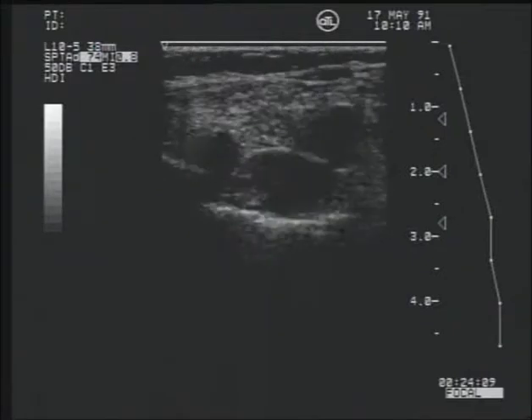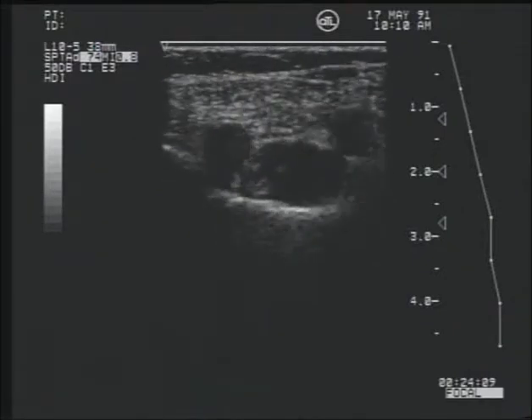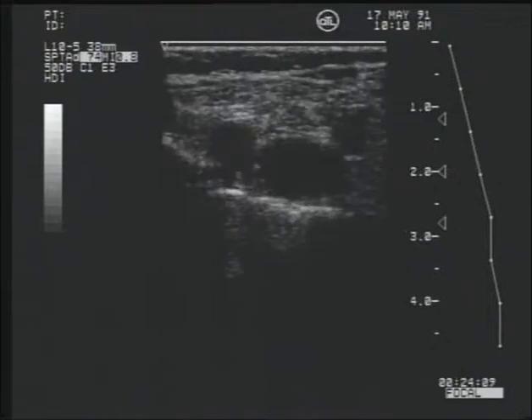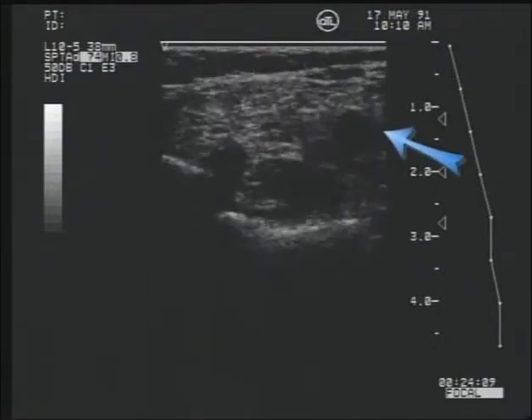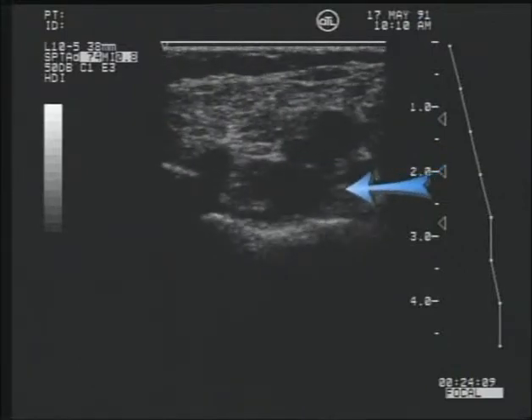Once a suspected cyst is identified, care should be taken to make sure it is not an enlarged vascular structure by identifying the popliteal vessels and noting the separation between the vessels and the cyst. With further injury, a popliteal cyst may rupture, resulting in fluid leaking into the upper calf. Baker's cysts are a fairly common occurrence, and because differential clinical diagnosis between Baker's cysts and venous thrombosis can be difficult, venous imaging has proven to be a useful tool in sorting out such diagnostic dilemmas.